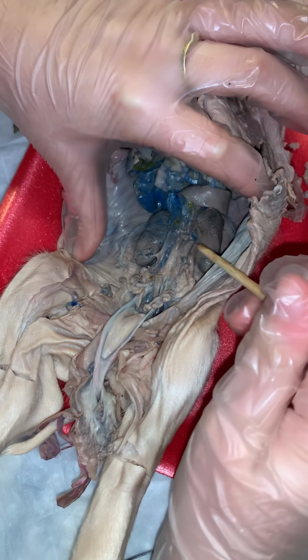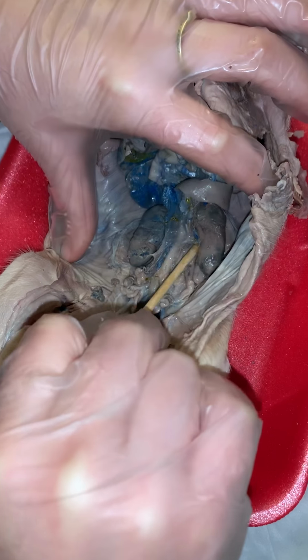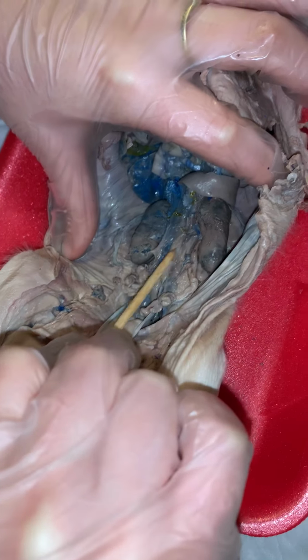The abdominal aorta, I know it's going to be difficult to see, but it's the structure that runs right here, that you can kind of see my probe running up and down. That's the abdominal aorta. The renal artery is right here. It's this blue artery, or not artery, I'm sorry, the renal vein. The artery lies kind of behind it. It's difficult to see, but it is directly behind it.